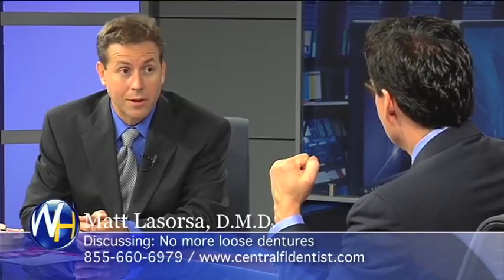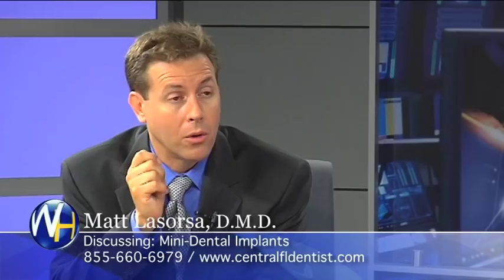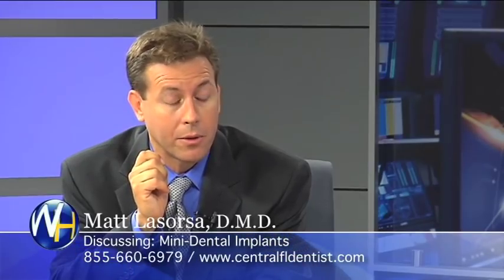Yes, we put 4 mini implants on the lower, and we have the housings built into the denture, and then they are secured onto the implant. So she can take them on and off. And these are made to wear most of the time. You don't have to take them out at night. You're supposed to actually leave them in.